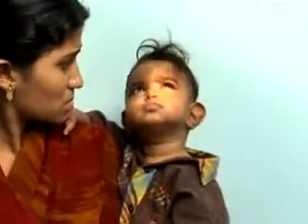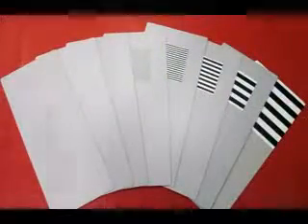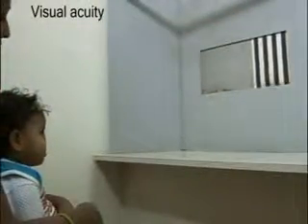If the infant is less than a month old, measure the current visual function by assessing the response to light. For an infant aged between 1 and 6 months, measure the current visual function by checking the fixation to light. In older children, we use Teller acuity cards or the preferential looking test.